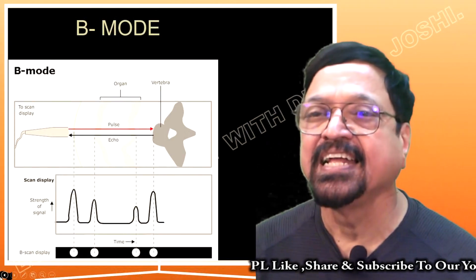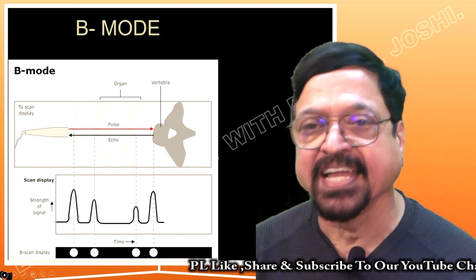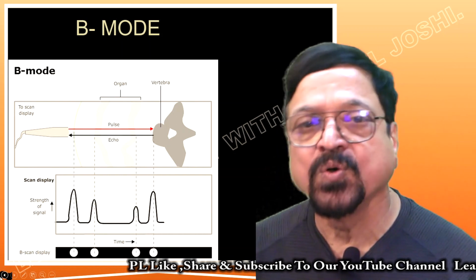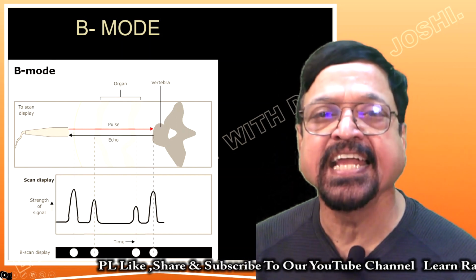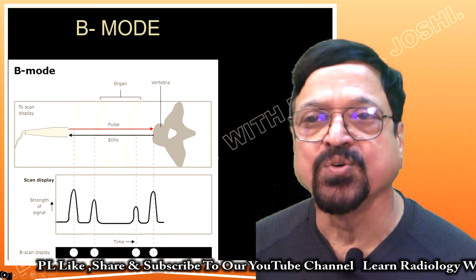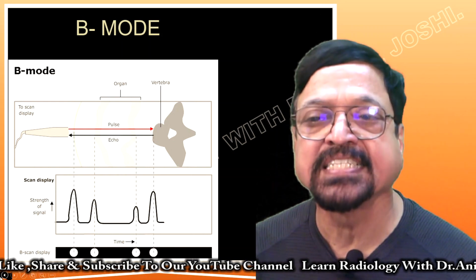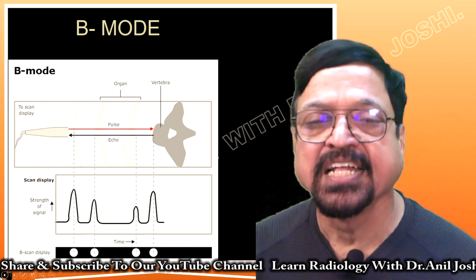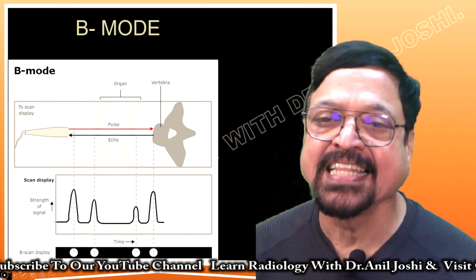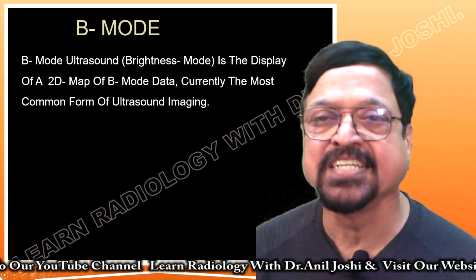Here we are seeing it. Now the probe is producing the waves, and below we are seeing it graphically. As I told you, the stronger the echoes, the brighter they will be presented on the screen, and that depends on the characteristics of the tissue. So here what we are seeing is an organ, a vertebra, that is bone, and soft tissues, and you can see how the echoes are produced. The echoes which are produced create a signal in the transducer. Again, this part is covered in some other lecture extensively. Do visit for this reason.